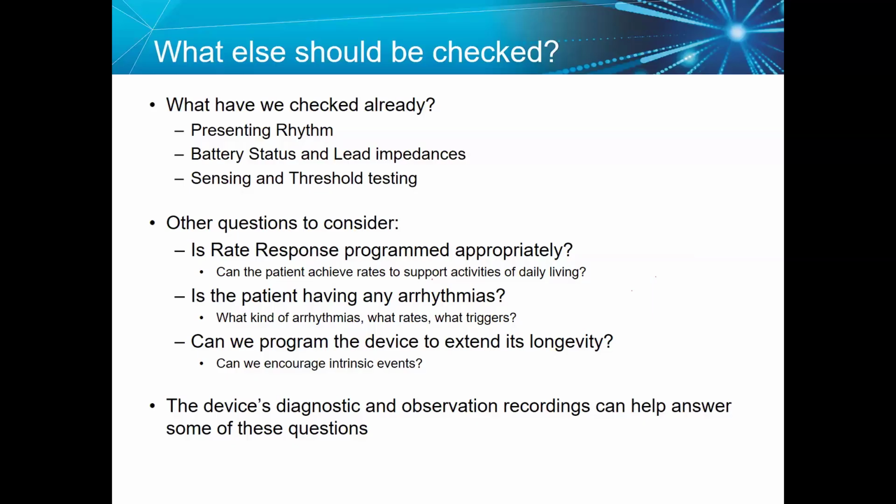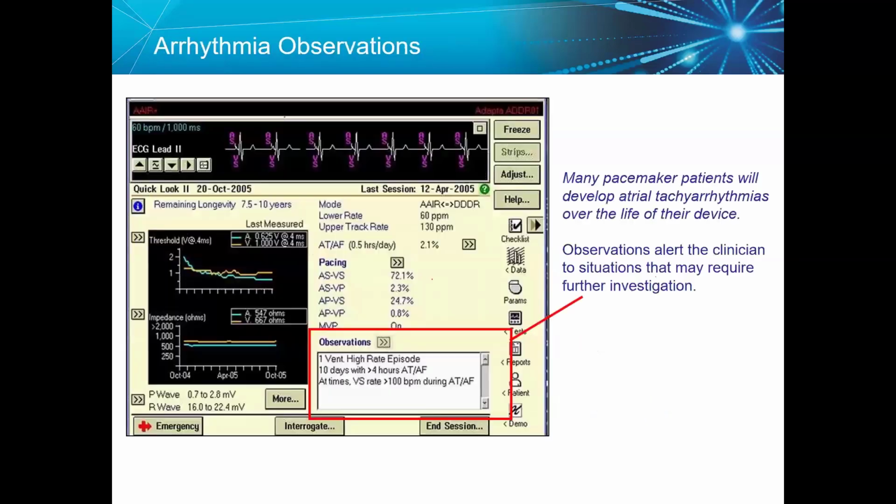Is the patient having any arrhythmia? What kind of arrhythmia? Can we program the device to extend its longevity? Can we encourage intrinsic events or not? The device diagnostics and observation recordings can help answer some of these questions.